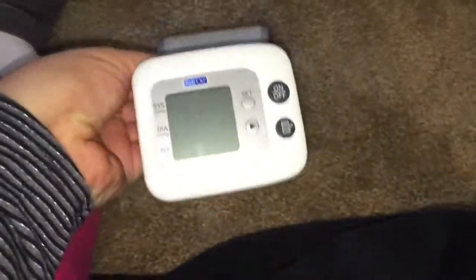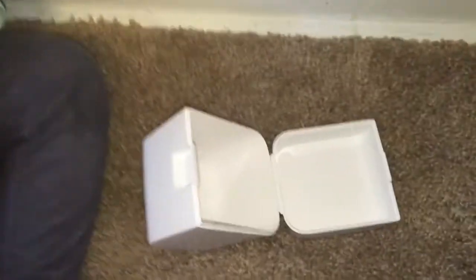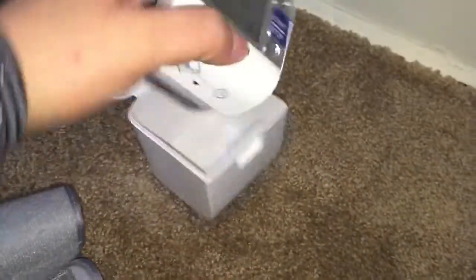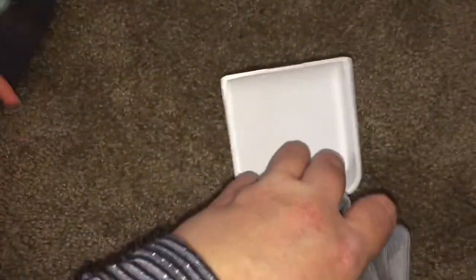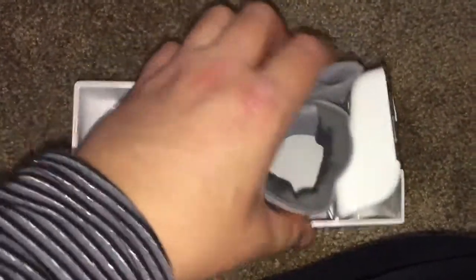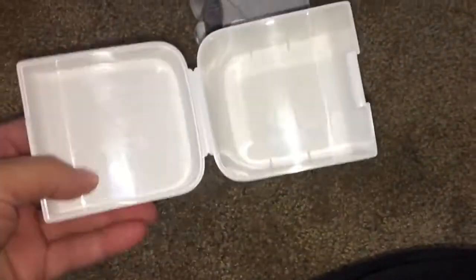The Omron comes with a case, but I don't really use it because it's very snug. As you can see, the monitor is literally right against the plastic and I was worried it was going to scratch the screen. I don't know why they didn't just make the case a little bit bigger.